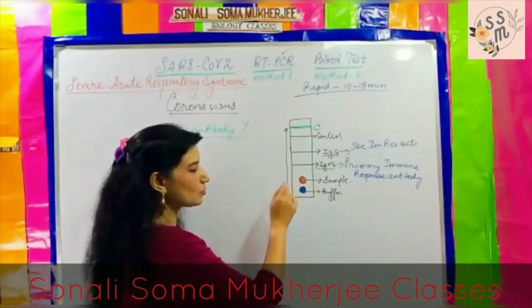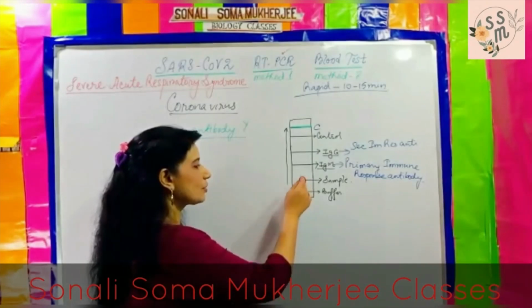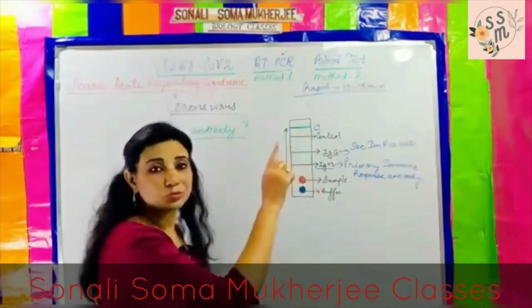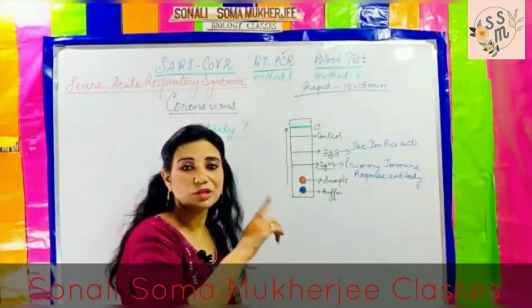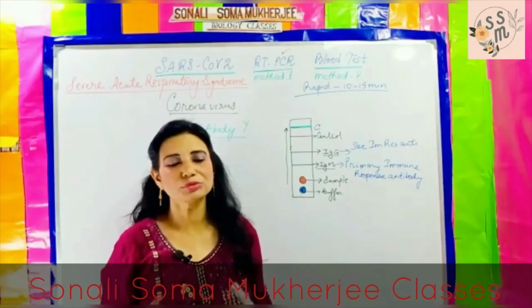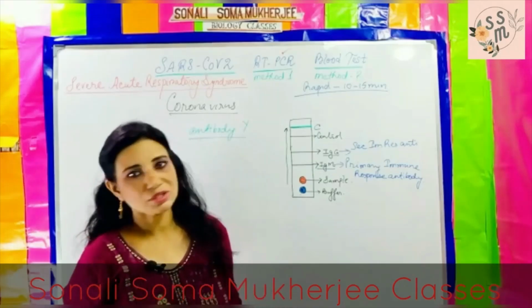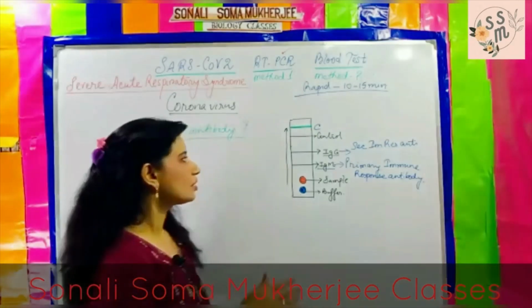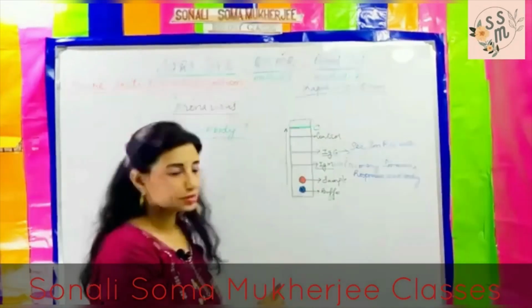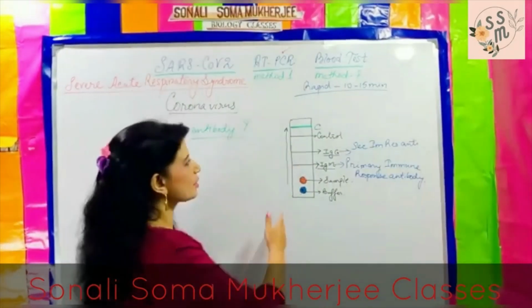As I have said, we put a little bit of blood over here, a little prick, we put it over here, and then we add the buffer solution to it, and we run the test. And we look for the line; we have to wait for 10 to 15 minutes. Normally plasma, which is the watery content of the blood, is to be taken. But at home, if you do this testing, it is not possible for you to extract the plasma, so we are going to do it with the whole blood. Due to the capillary action, this buffer is going to carry blood and its components across the kit.